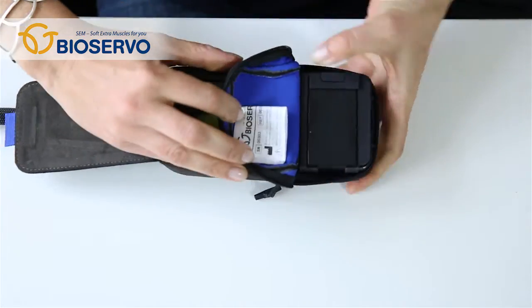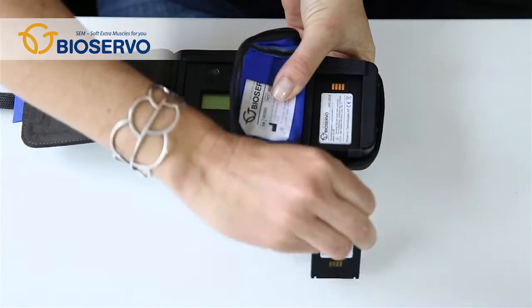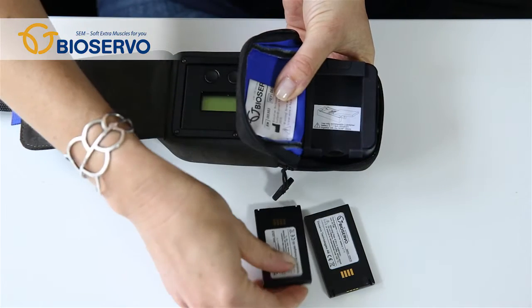If you are not using your SEM glove for a week or longer, remove the batteries. This will enhance battery life.